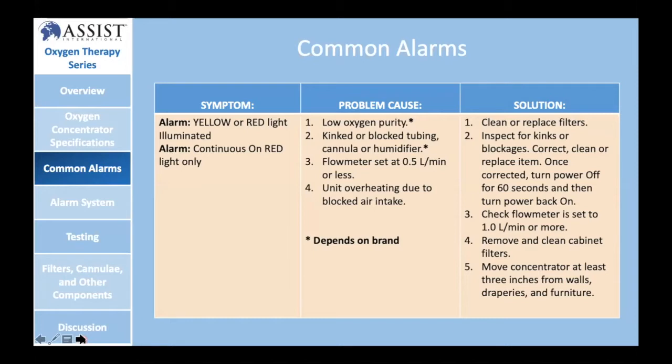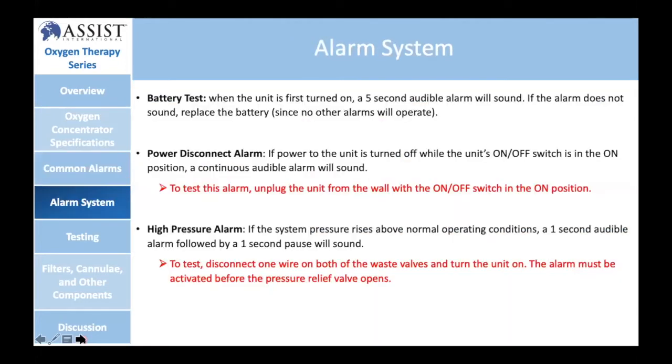If any of you need support with finding technical manuals, please reach out to us. We're happy to support you and see how we can provide those resources to you as well. Oftentimes, these technical manuals will have very detailed specifications on alarms and troubleshooting mechanisms that are specific to that model of the oxygen concentrator. And that would be very critical for you to know, or for your technical teams to know.